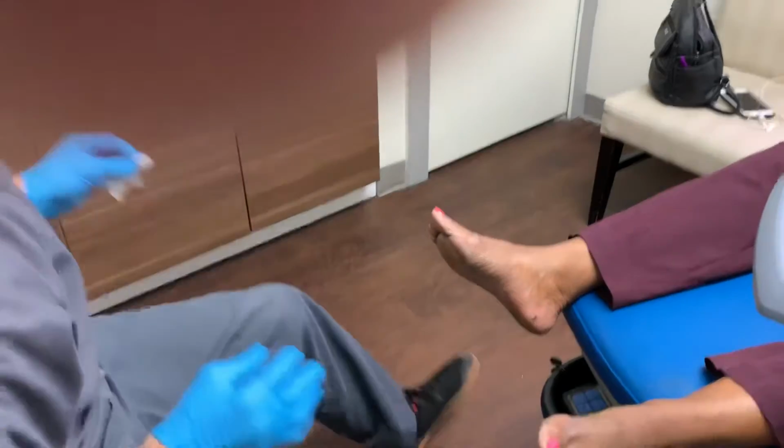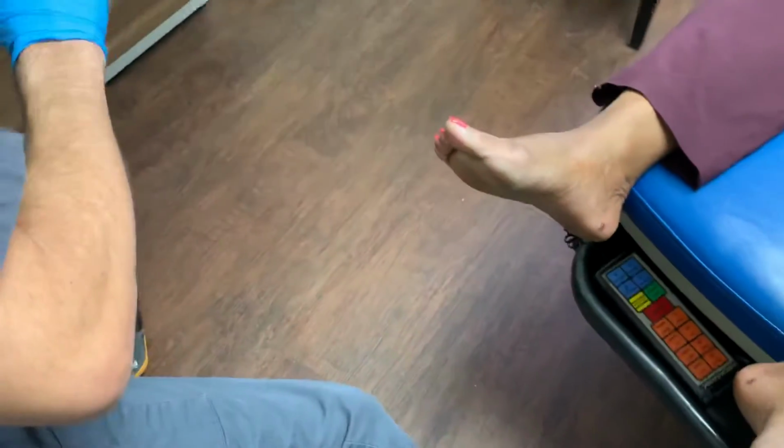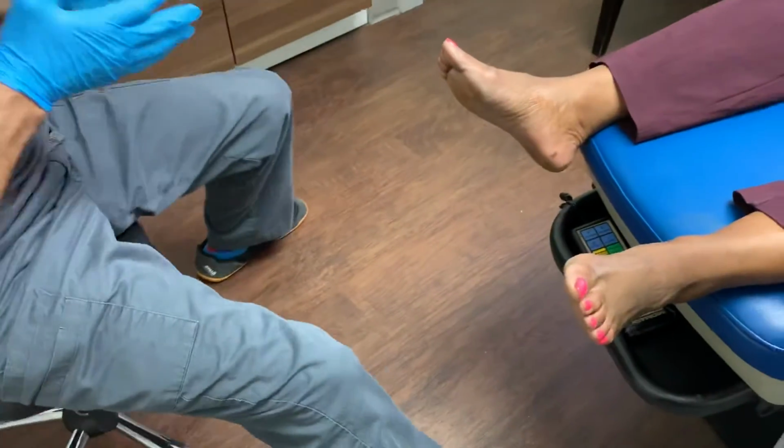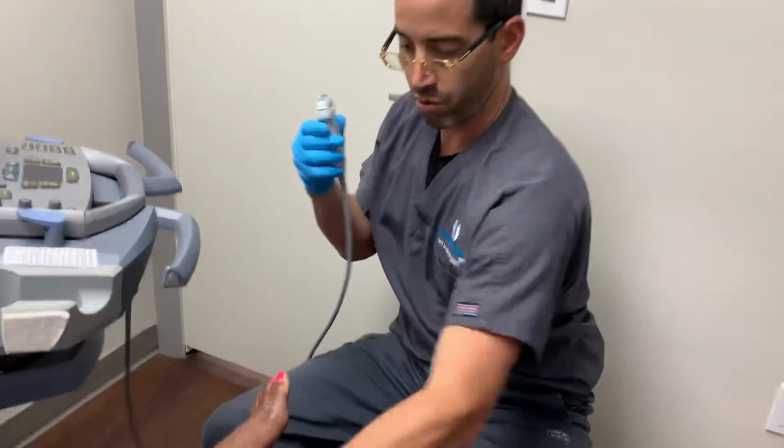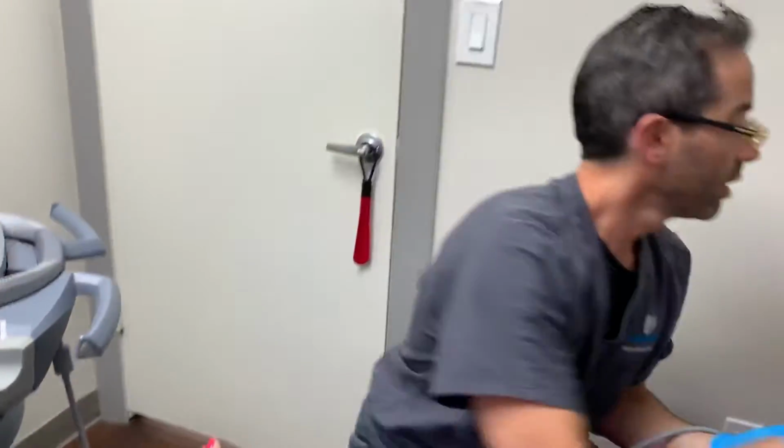I'm gonna go ahead and clean this, clean that. I always tell the patient that no one likes an injection. They're gonna feel just gonna make sure that no one's okay, perfect. So I like to use the ultrasound always.